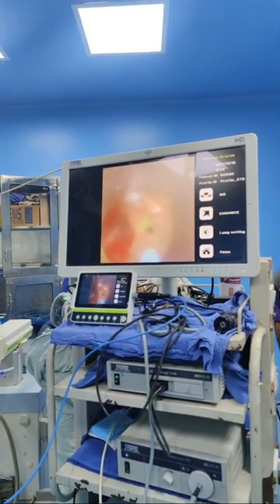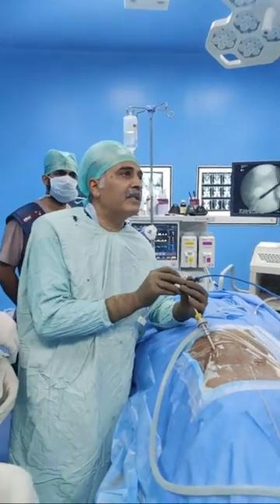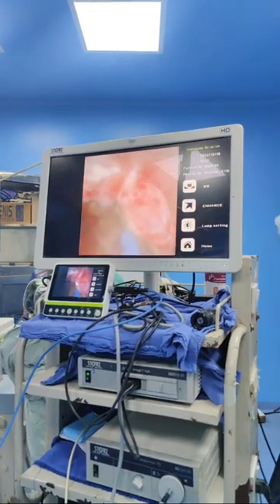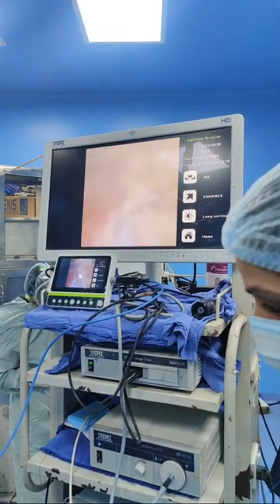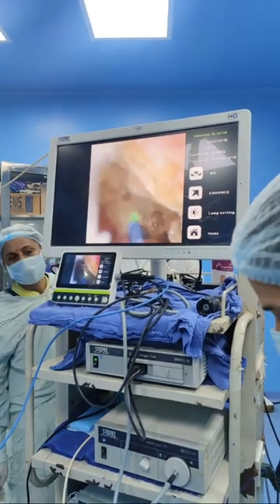So there's a stone which is going into the other calyx. Let's see the pneumatic sheath.